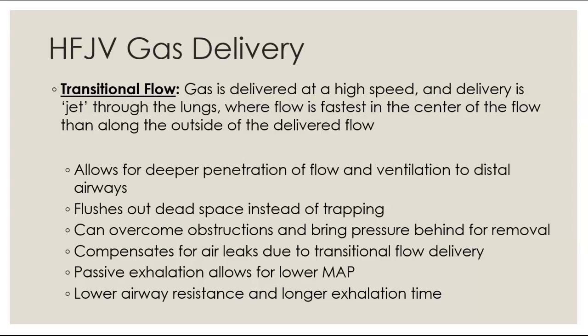So remember, dead space is ventilation that is just hanging out. It's not part of the ventilation or perfusion or any of that gas exchange of the alveoli. It's just air that's hanging out in free space. It's dead weight air. We can overcome obstructions and bring the pressure behind for removal. That's why it's indicated for meconium aspiration. Compensation for air leaks due to transitional flow delivery, because we're using that flow to basically help stent that airway open. And then that passive exhalation, I have pictures that'll show you, that'll make it a little easier to understand than me talking to you.